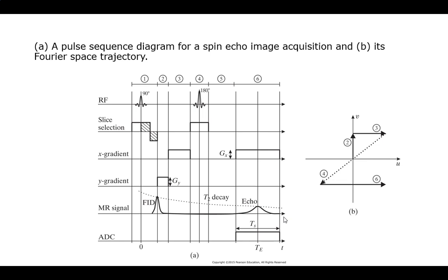It's a phase shift of 180, which is flipping the graph. So this right here is the result of you doing that echo kick. It's going to take you wherever you had set yourself up to be. It's going to do the 180. So you have to think, where do I want to do the readout? And you go, oh, I want to start here. I know I'm going to do an echo, which means I have to have a 180 kick in. So it's going to flip me. So then you have to set yourself up for the kick so that when the kick is done, you're ready to go. So you kind of have to think backwards when you're working on it.